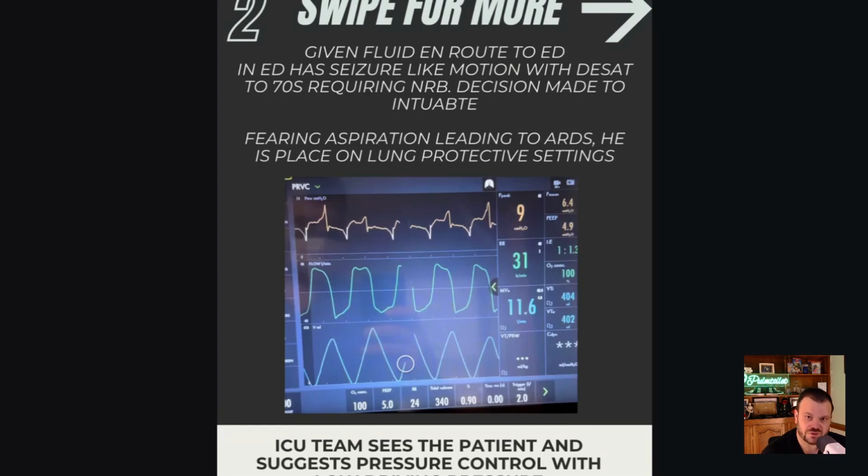So me personally, if I have to intubate someone who has metabolic acidosis and I'm going to have to squeeze every last ounce of minute ventilation I can out of them, what I do in the post-intubation period is get a time constant and figure out my max rate. I try to cheat below the max so there's a little bit of a fudge factor. So if I do the time constant and the max rate's like 28, I wouldn't make the rate 30, because I know I'm going to auto-PEEP. And that is a whole other set of issues.